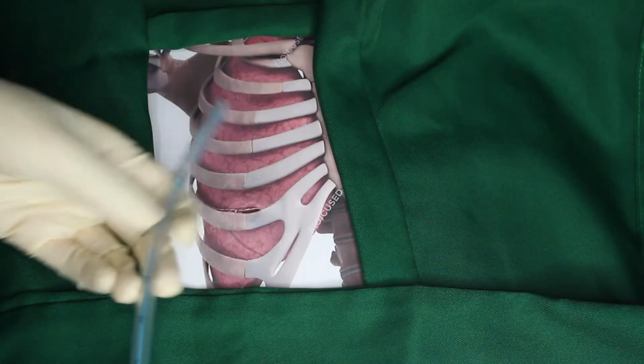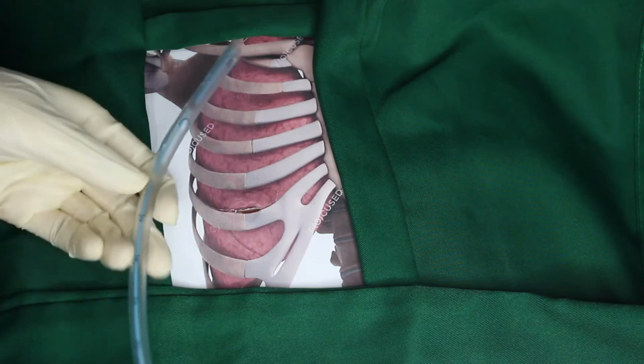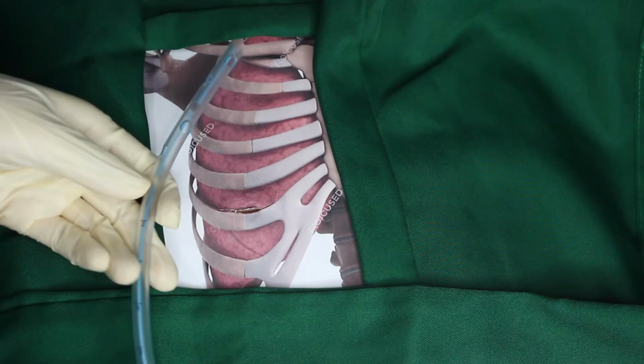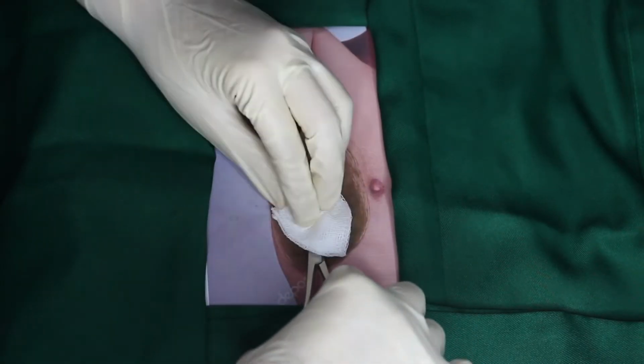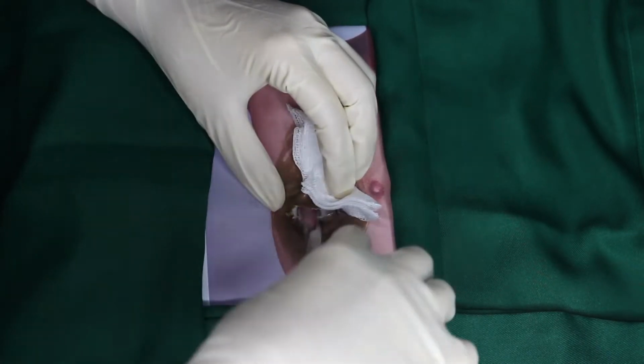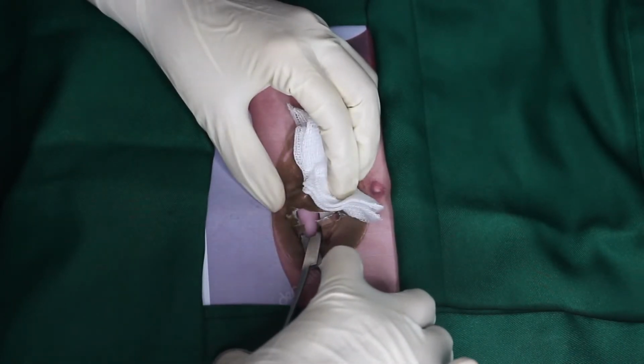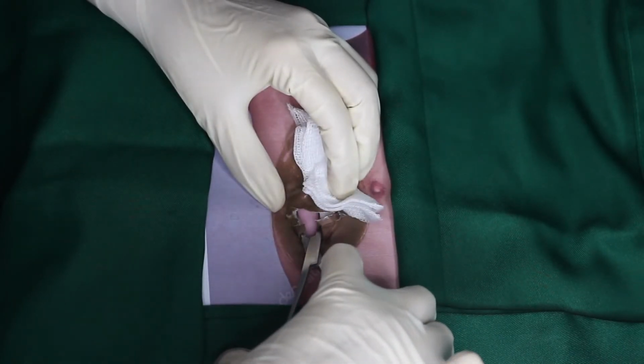Measure how far the chest tube is to be advanced after placement. The tip of the tube should be placed at the apex of the lung. Insert a curved Kelly clamp and cut or separate the tissues so as to create a tunnel or tract in the direction in which the tube is to be inserted. This tract should be directed posteriorly, cephalad, and medially.